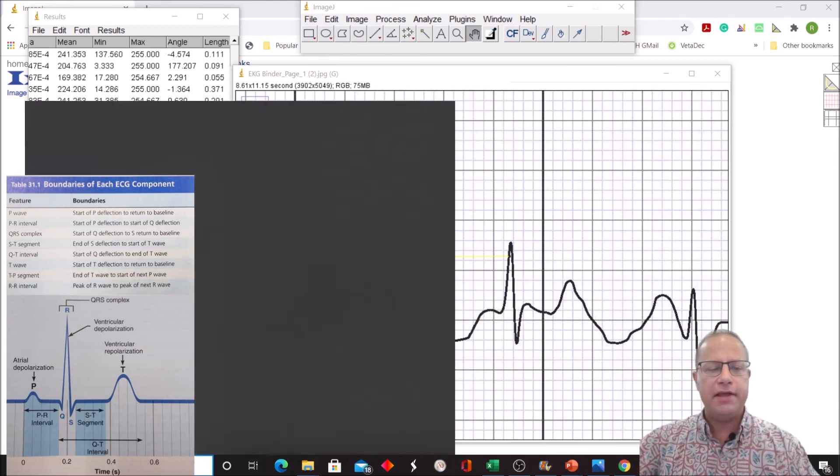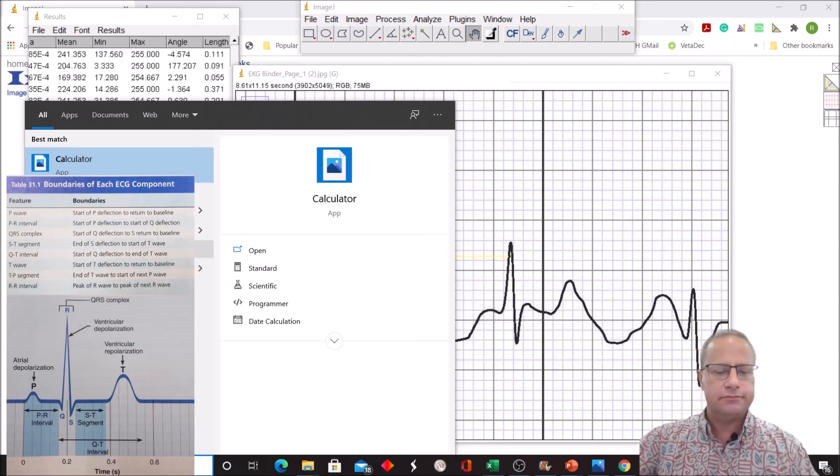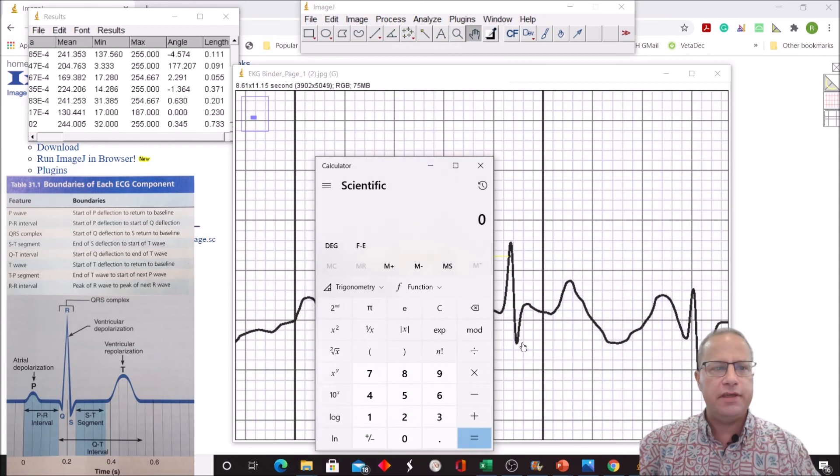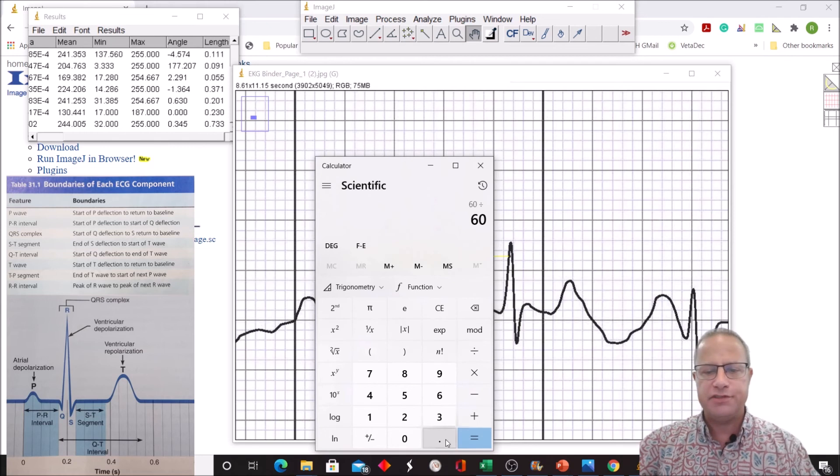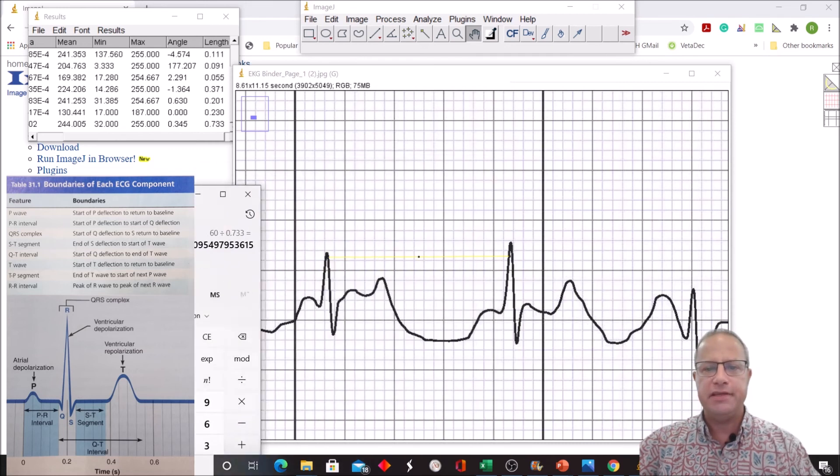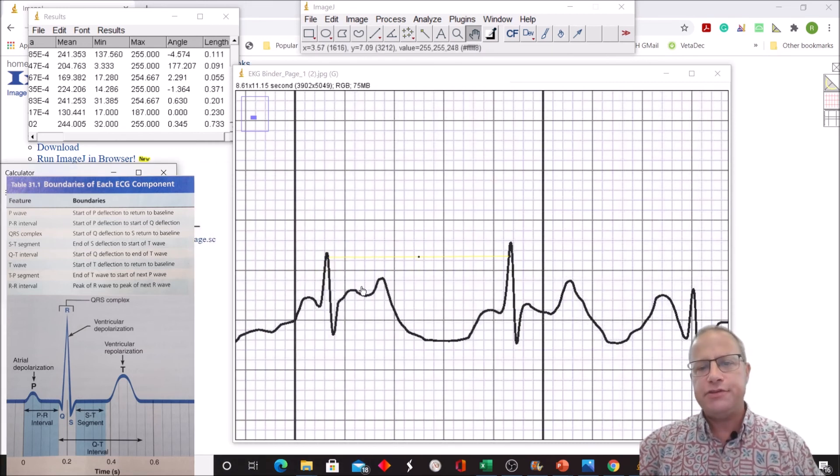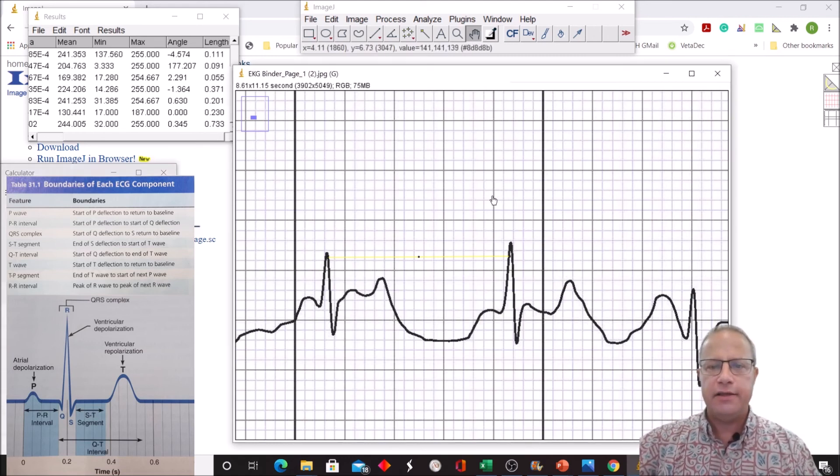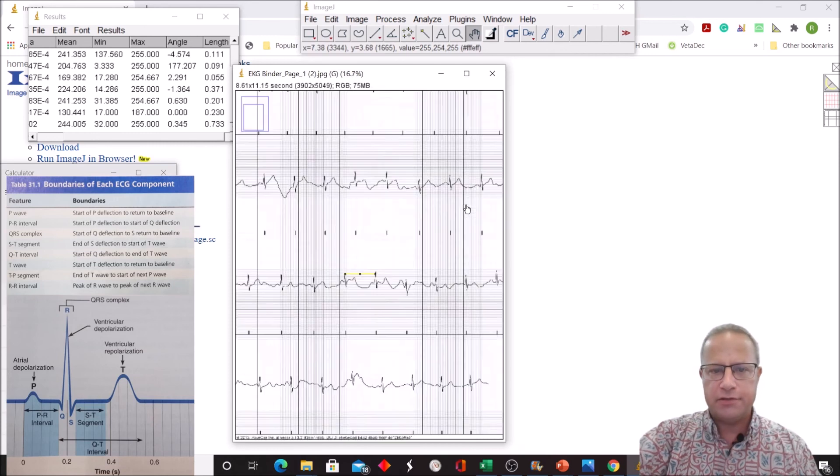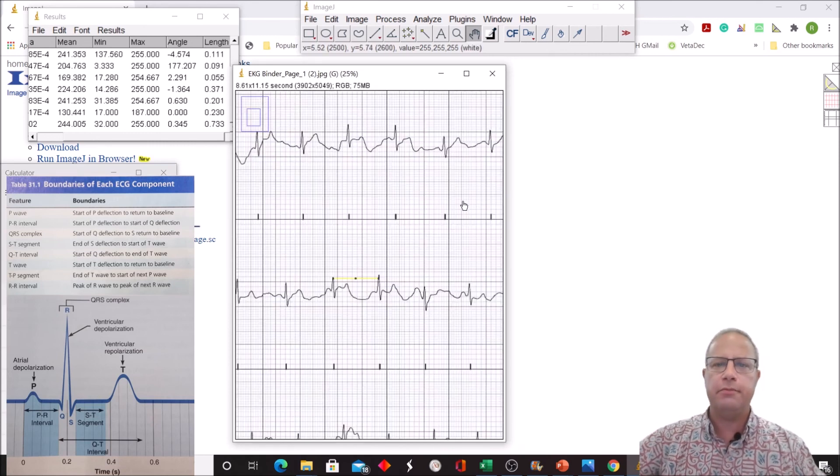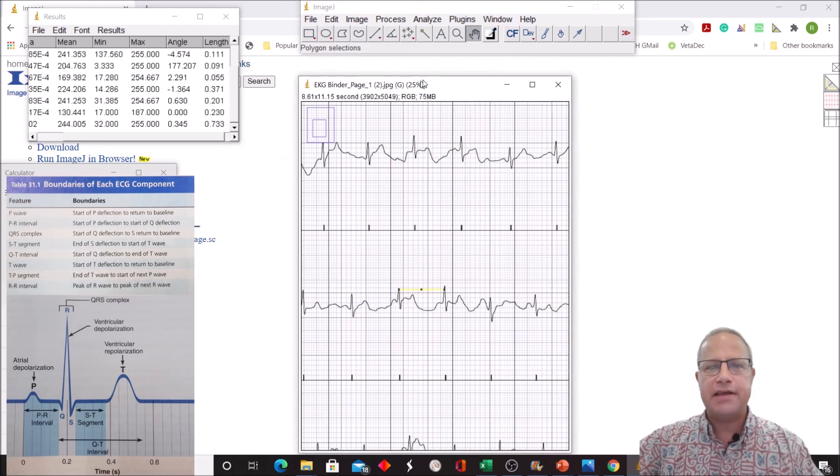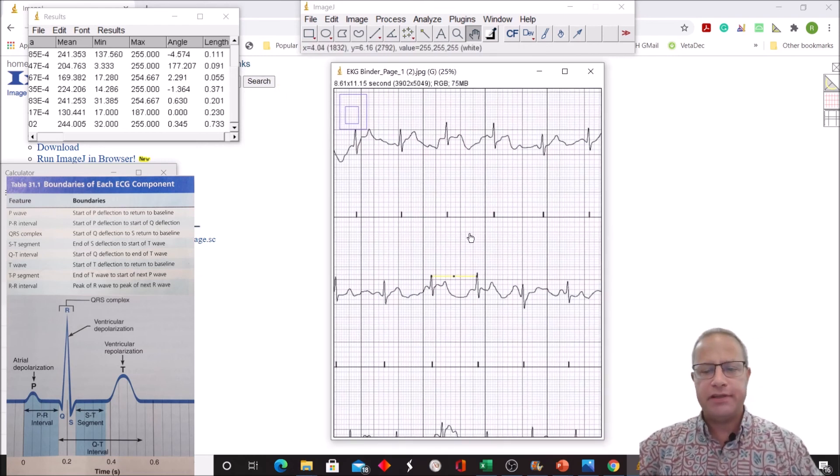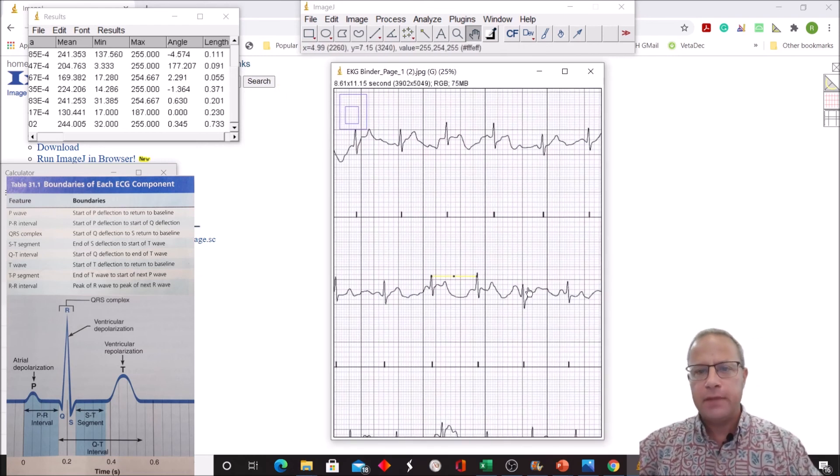To figure out the actual heart rate, we just go to our calculator. We take 60, 60 seconds in a minute, divided by that number, 0.733, and we get our heart rate, which is around 81.8 or 82 beats per minute. That's about normal for me. What you're going to see, though, is if you look at this entire EKG, there are some cases where the heartbeats are closer together and some cases where they're further apart. That has to do with breathing, because as you breathe in, heart rate tends to speed up, and as you breathe out, heart rate tends to slow down.